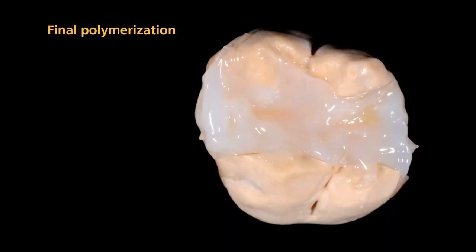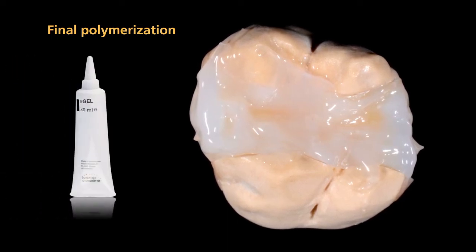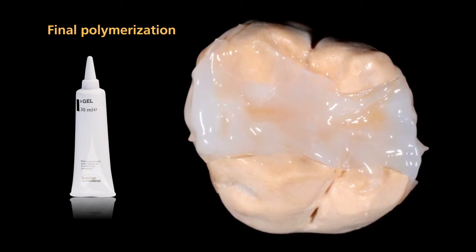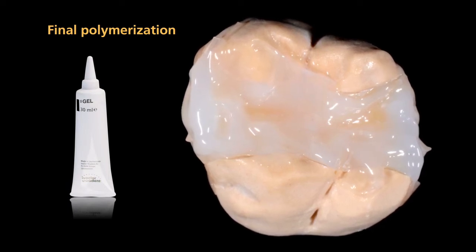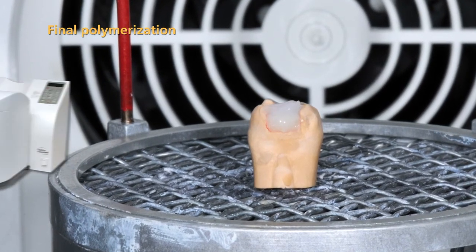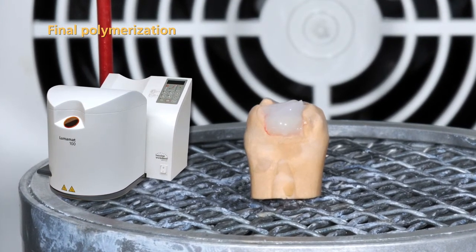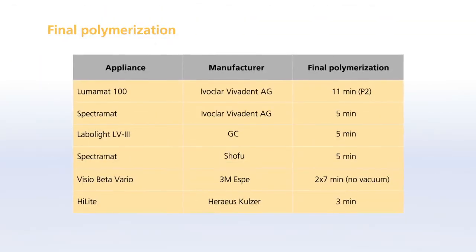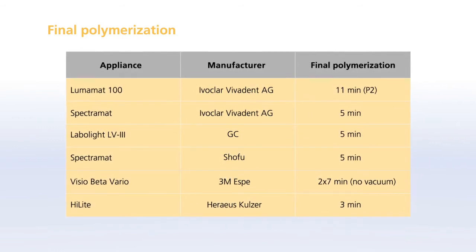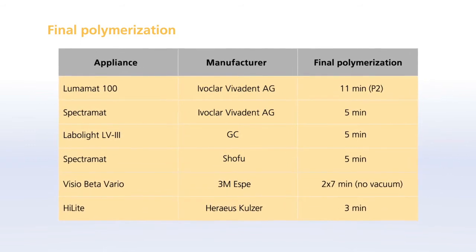For the final polymerization, apply a layer of SR gel onto the entire Nexco surface. Make sure that the layer is not too thick and that all areas are fully covered. Secure the die on the object holder and mount them in the correct position in the Lumamatt 100 light furnace. Observe the following parameters to conduct the final polymerization. If you use other polymerization devices, please refer to the instructions for use.